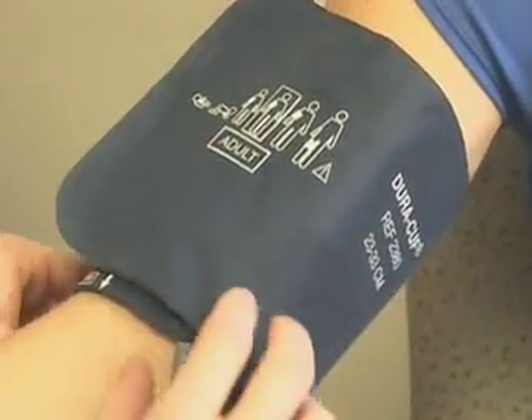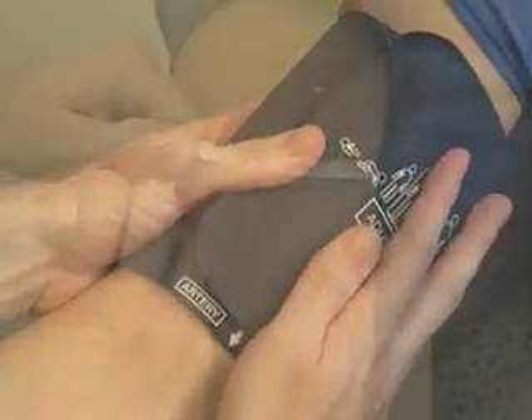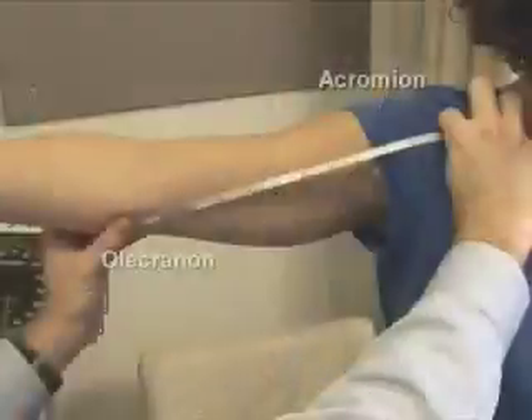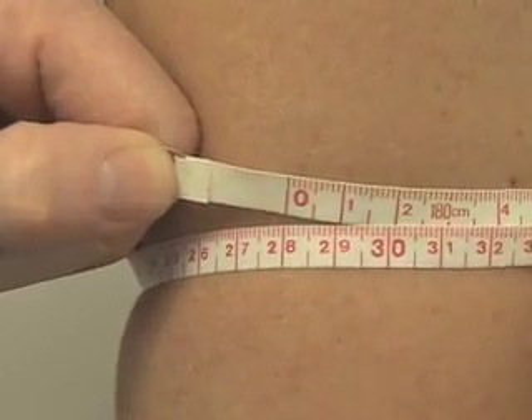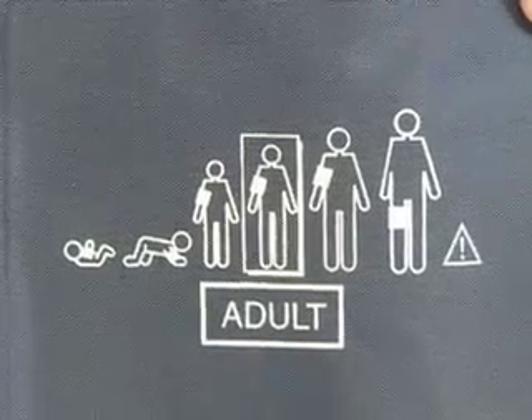A common error in taking blood pressure is the use of an improperly fitted cuff. Selection of an appropriately sized cuff requires assessment of the arm circumference. The midpoint position is determined by measuring the distance between the olecranon and acromion processes. The arm circumference is then measured at the midpoint. Once the arm circumference has been determined, the appropriate size cuff can be selected.